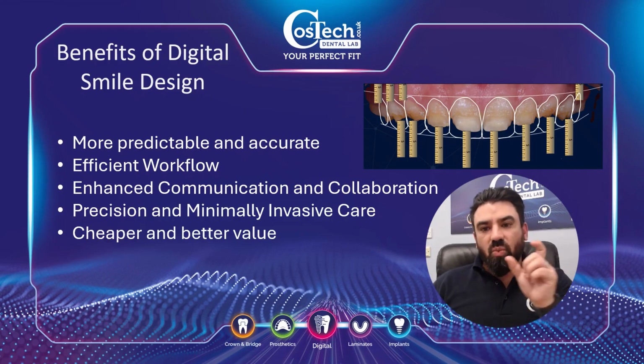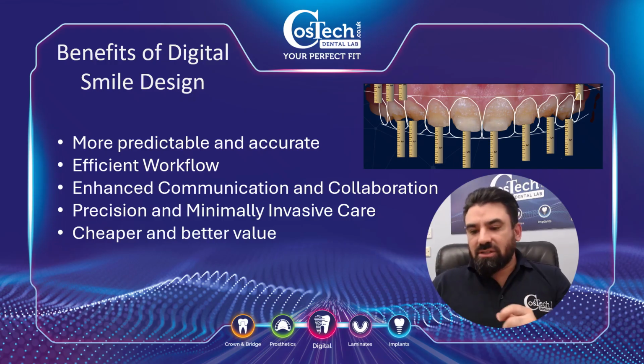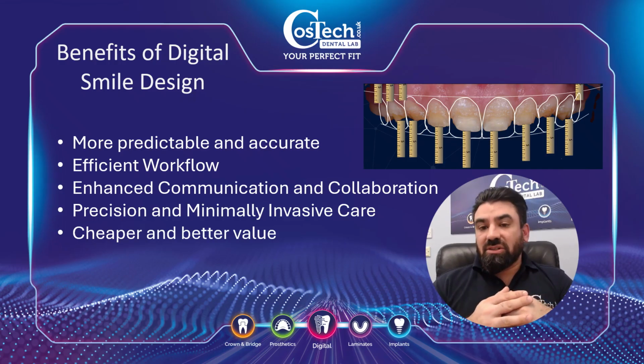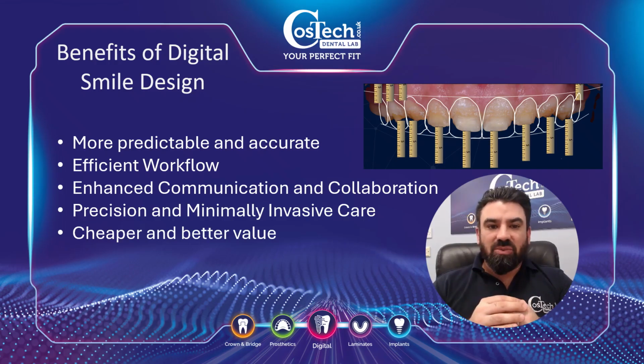We can have one design which we use, and you would be like, okay, I need temporaries on it. I want to do direct composites over the top, prep guides. We can even do test run smiles. So we can do temporary acrylic, so the patient can do a test drive before they actually commit to a final restoration. So all of these things make the smile design on the digital side a lot better value for money, and also a lot more predictable. When the patient says, yes, that's exactly what I want, that is what they will actually have at the end of the treatment.